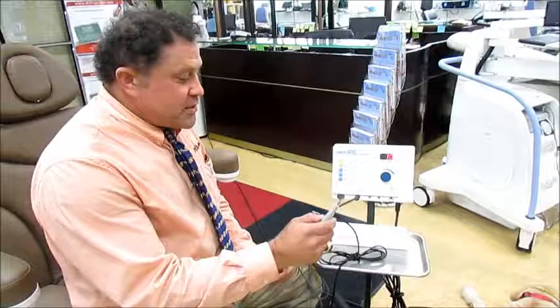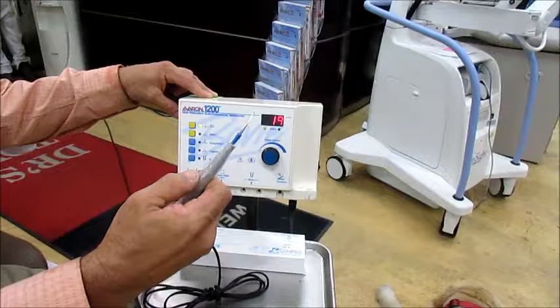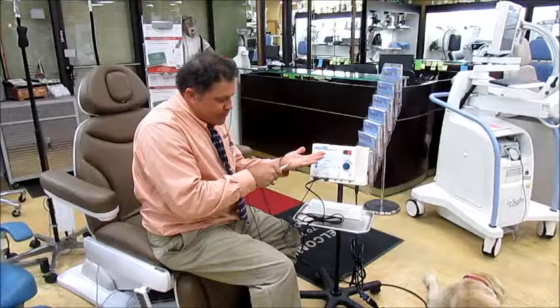So anyways, this is a little Hyfercator, and this is how you can turn it up or turn it down. Now if you turn it down low it's 19. I've got a grounding pad on, but for a Hyfercator you don't. All I do is take this, turn it on, and then you can see — it burns whatever you're trying to do.